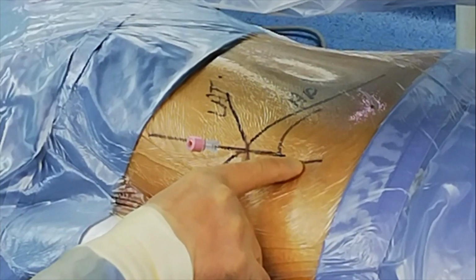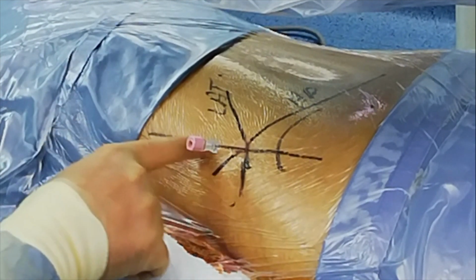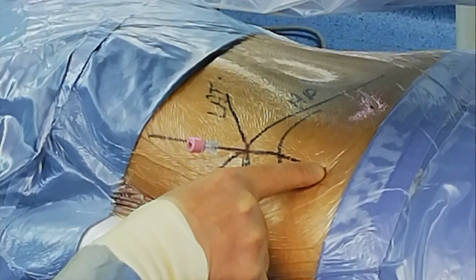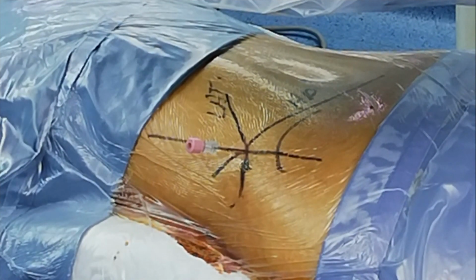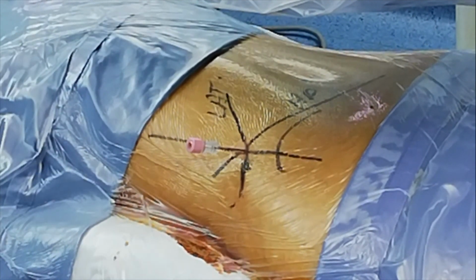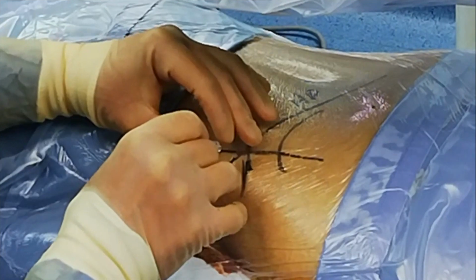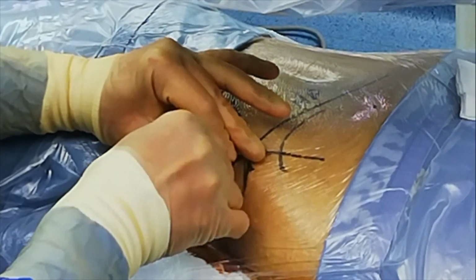So we decided the entry point, the meeting of the lateral and the AP lines on the 12 centimeter parallel line for L4, L5, and L5 S1, and the landing point will be in the posterior upper corner of L5 on the lateral, and at the medial pedicle wall on the AP. So that's the first step, okay? And then I'm going to do the wire exchange.